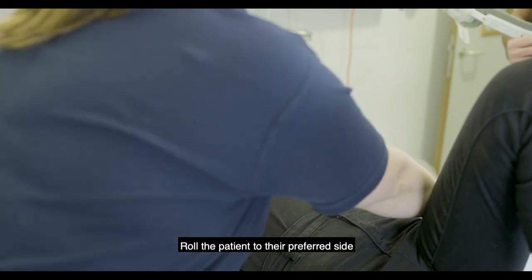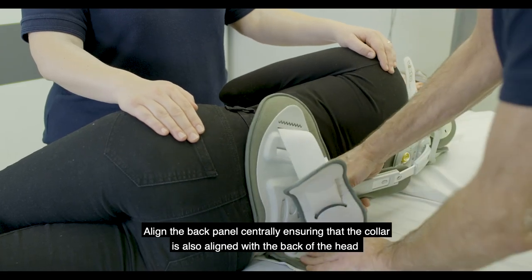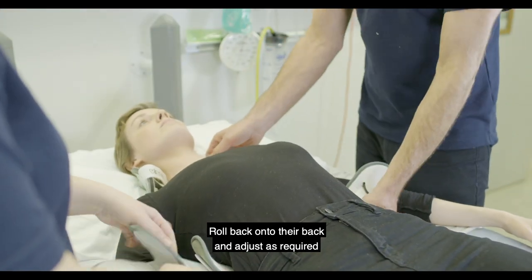Roll the patient to their preferred side. Align the back panel centrally, ensuring that the collar is also aligned with the back of the head and the lower section of the brace around the mid-thoracic spine. Roll back onto their back and adjust as required.